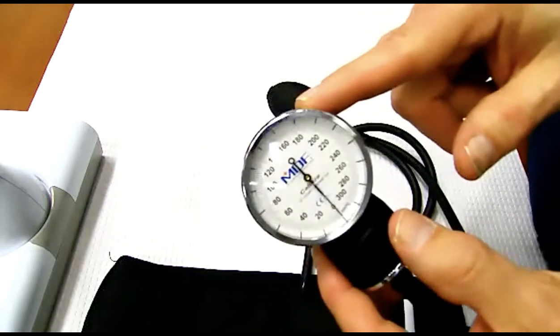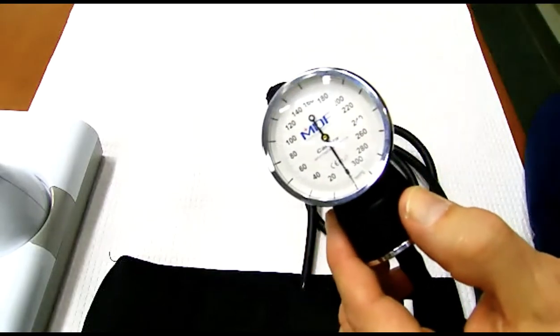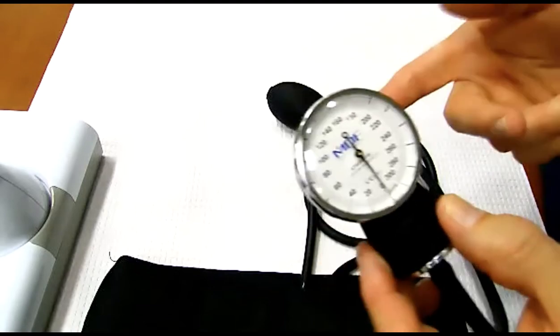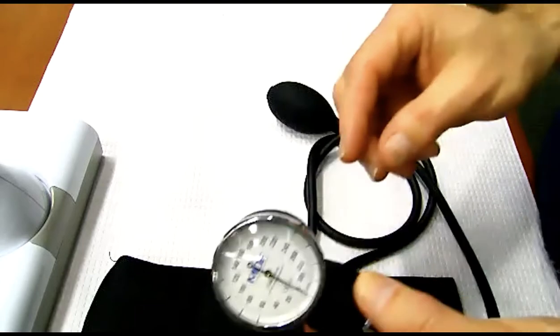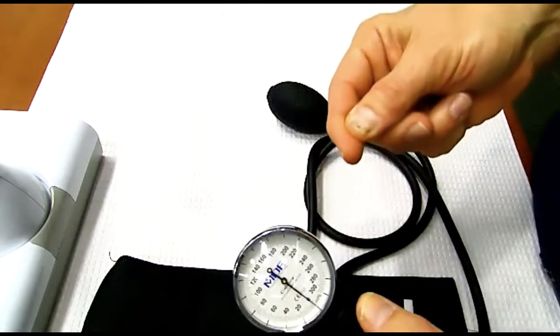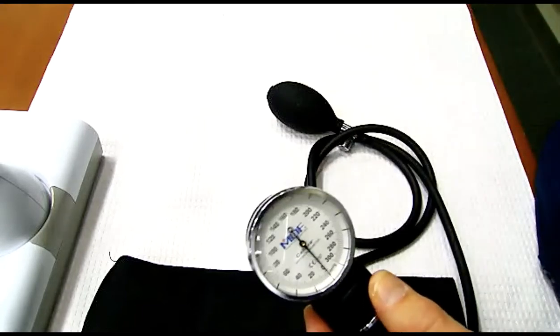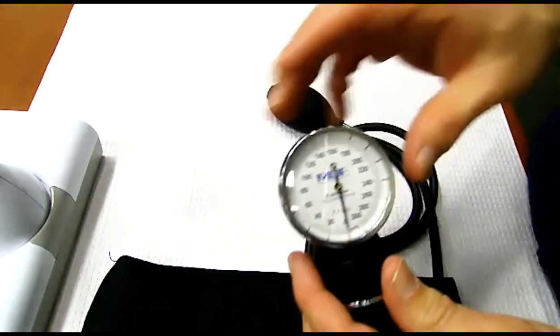When you use any sort of manometer or pressure gauge for blood pressure, we measure it in units of millimeters of mercury, which is kind of weird because there's no mercury in here, right? But think of the old-time ones. There was a glass tube and there was some of that silver mercury, and you'd pump it up and the mercury would rise up in the tube. And so that's how they would measure. No mercury on here, but realize the units are in millimeters of mercury.